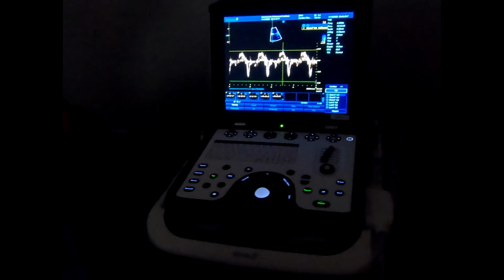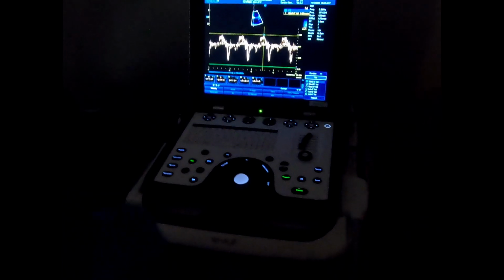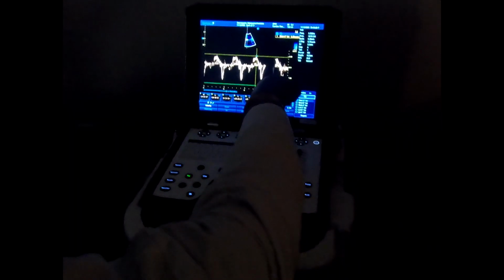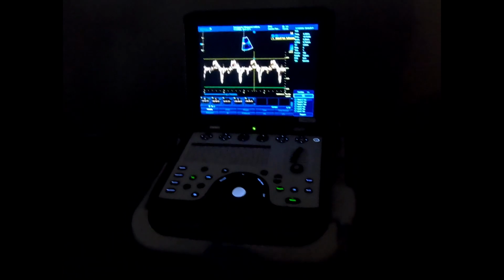I will show you the pulmonary vein next. This is a TDI. We're supposed to go with the highest velocity, and that's S2. This one is S1 prime, this one is S2 prime, but I choose the S2.